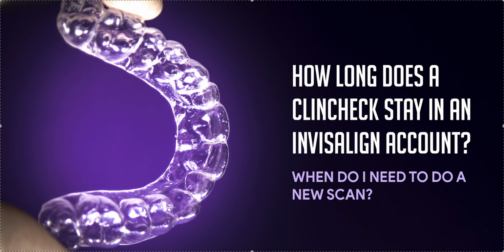The first provider would, oh, interesting. This is new. I lied. Okay, now they're saying the first provider does not have to sign the patient transfer form as long as the patient and second provider do, but she would have to have her Clin ID. I was wrong. That was the old way to do it. This is a new way. Oh, I learned something new. Otherwise, she could just start from scratch with the second provider: new records, new prescription, new Clin Check. Okay, so no, the first provider does not have to sign.